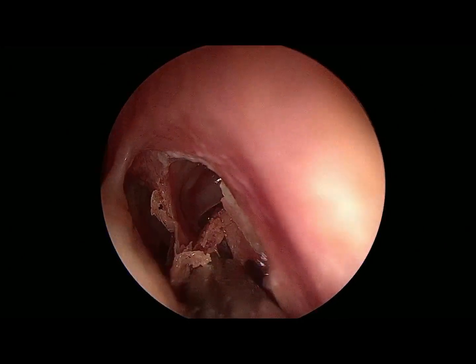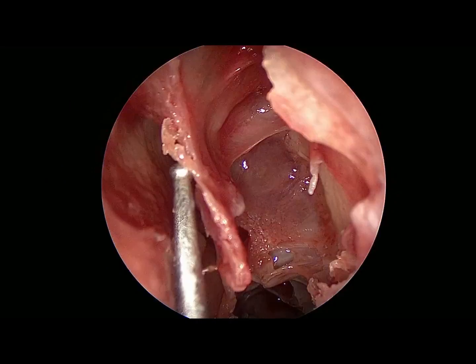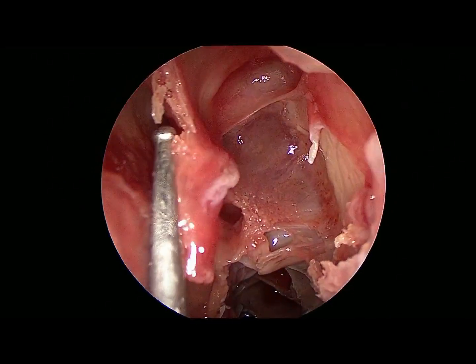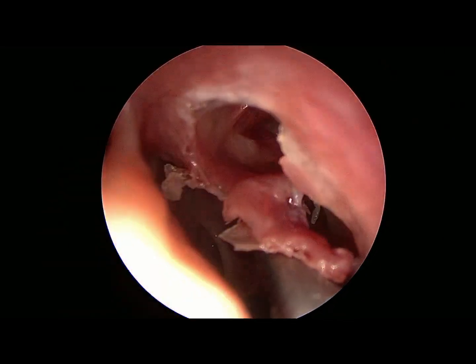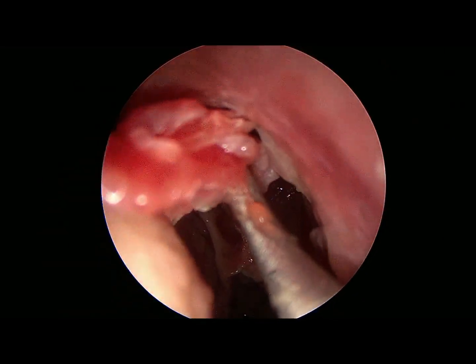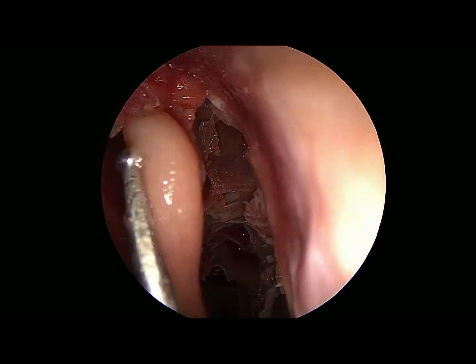Now this is otherwise called uncapping the egg. See now, gently you take a ball probe and go behind the posterior wall of the agger cell and remove the cell from posterior to anterior. So never do it blindly.